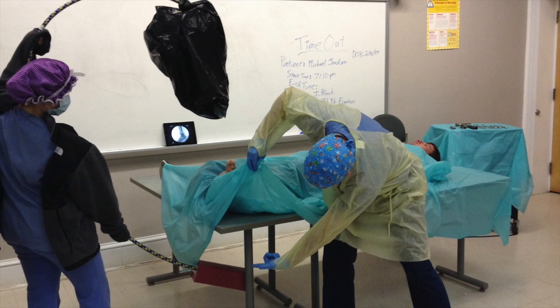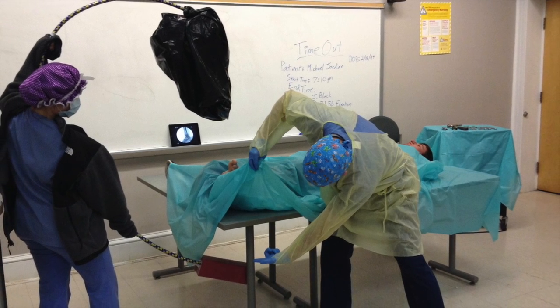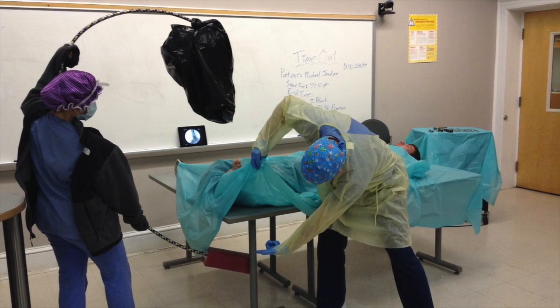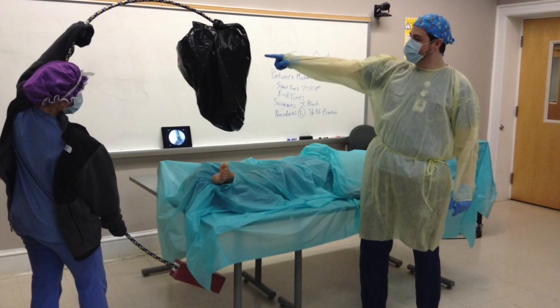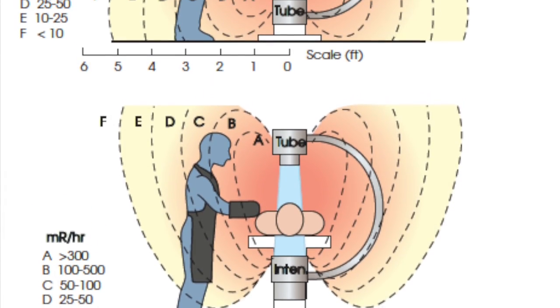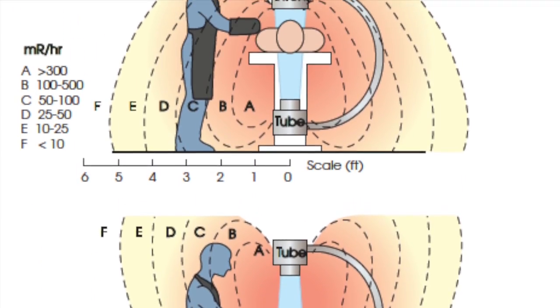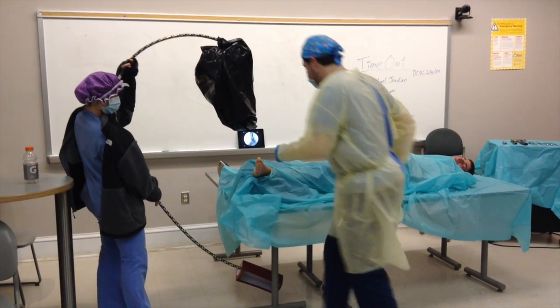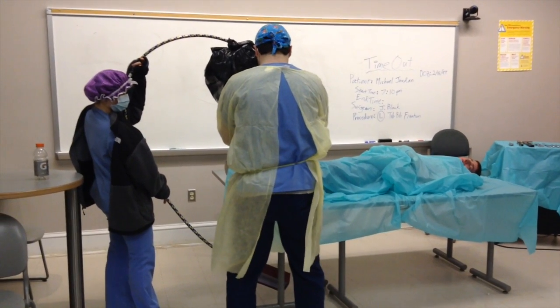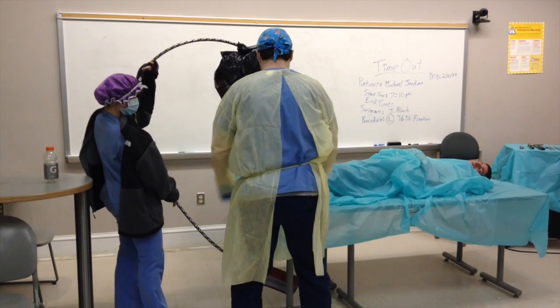The recommended configuration for fluoroscopic equipment is that the X-ray tube always be placed below the patient and the II or FPD placed above. With this configuration, less radiation reaches the facial and thyroid region of a person standing next to the patient. One should also attempt to stand at a 90-degree angle to the radiographic equipment and patient to avoid excess scatter radiation exposure.